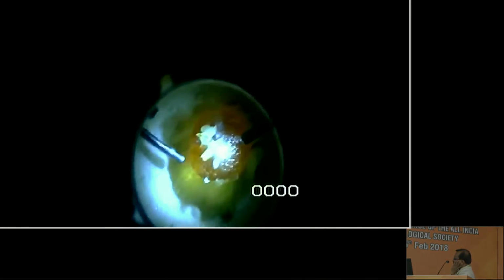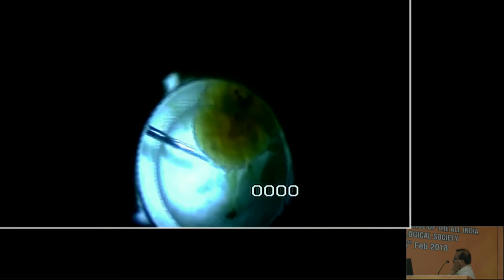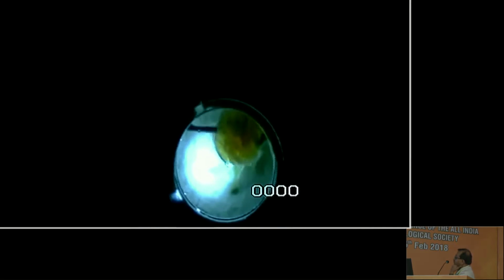Perfluorocarbons are expensive and are usually discarded after evacuation from the eye post-surgery. However, used perfluorocarbons can be stored and utilized for floating up nuclei in model eyes. The technique of floating up the nuclei and the need to axialize the nuclei, which tends to drift off towards the eye wall, can be practiced.